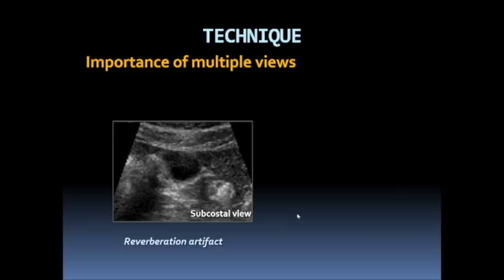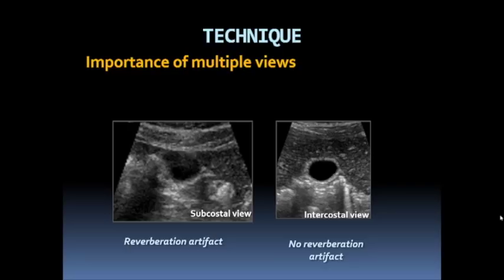This image illustrates low-level internal echoes within the gallbladder lumen from reverberation artifact, which we often see when patients are scanned from a subcostal view. A few moments later, scanning from a more lateral and superior approach using the liver as an acoustic window, we eliminate that reverberation artifact.